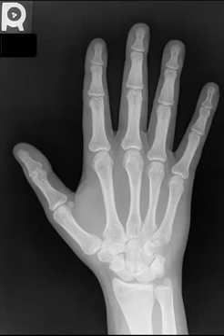There are multiple accessory projections that we will not discuss in this tutorial. However, they are very useful for evaluating anatomy that is not well seen or even pathology that needs further evaluation. Let's begin with some normal anatomy.